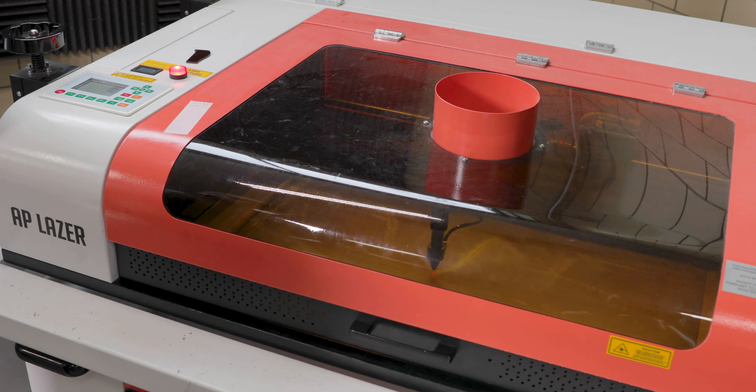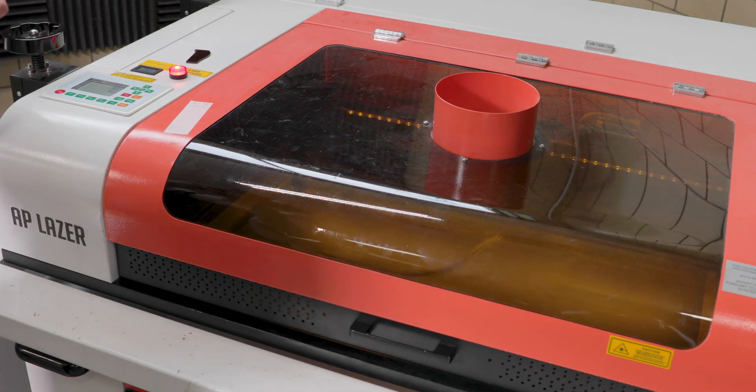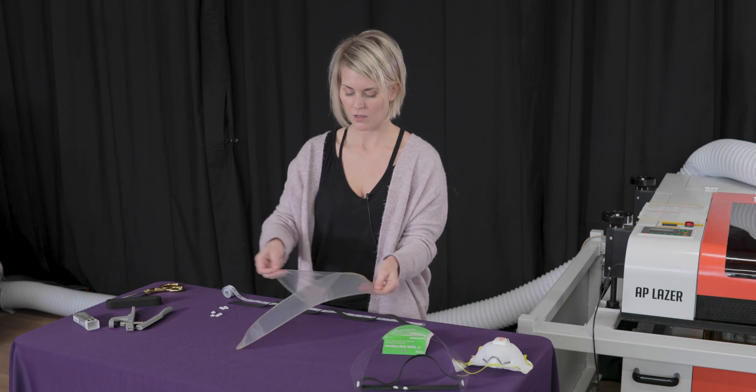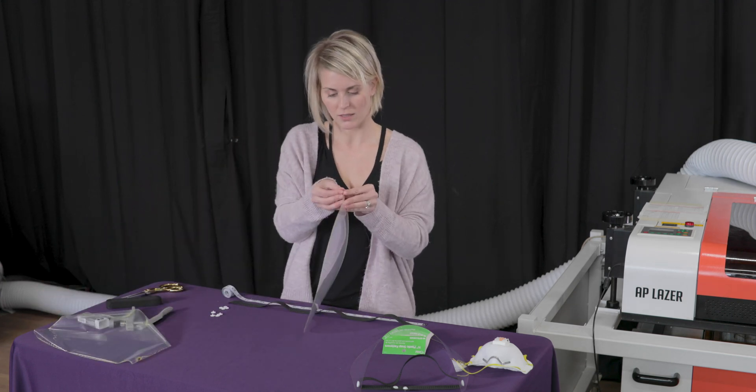You could use the array feature on your AP Laser to mass produce these and have a little production line. Once you have your piece of polycarbonate cut, you're going to want to peel off the two protective layers that are on the front and the back.